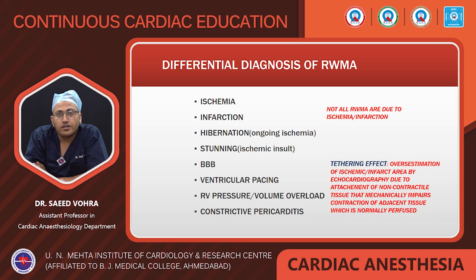Now, the tethering effect. Due to the tethering effect, there may be an overestimation of the ischemic or infarcted area by echocardiography, due to the attachment of non-contractile tissue that mechanically impairs the contraction of adjacent tissue, which is normally perfused.